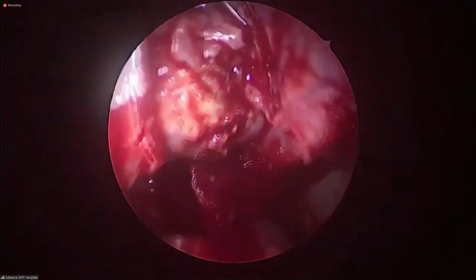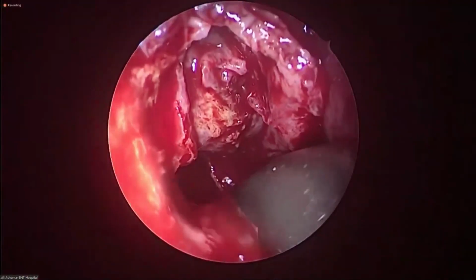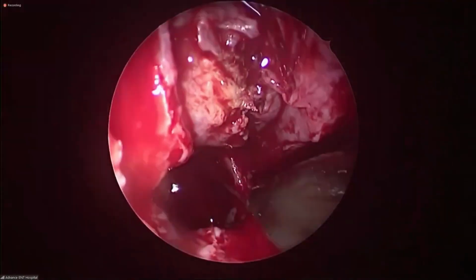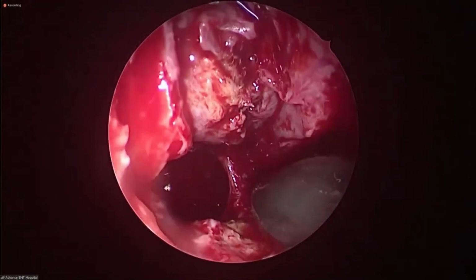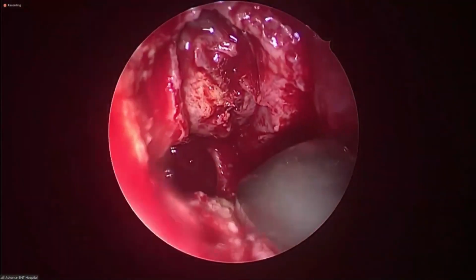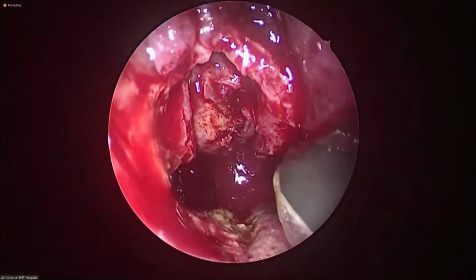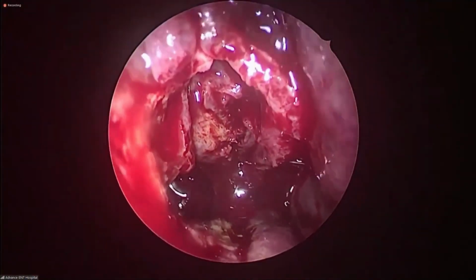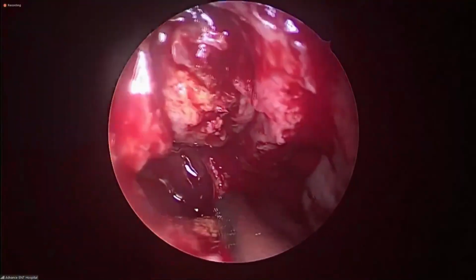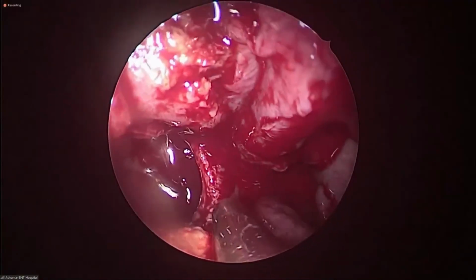These are vessels. Yes, sir. Then, problem.